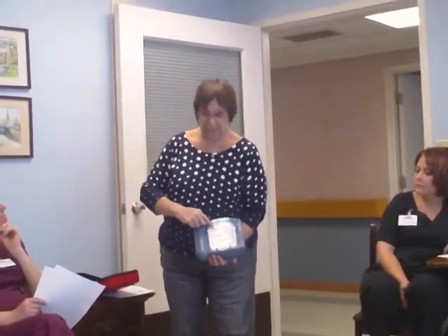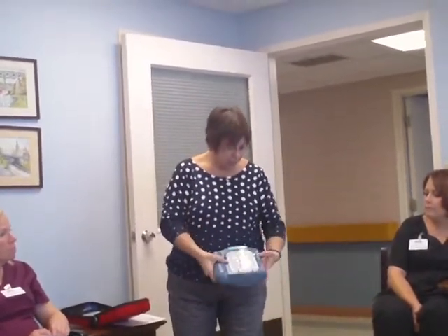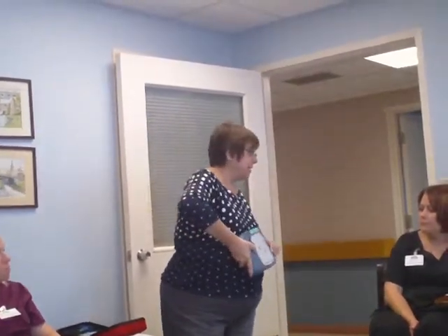This is like a cartridge in here. You pull this down and then it says peel back, and you peel back and the pads are in there. You place the pads right where they've always gone. And then you would just analyze it. If the shock is advised, this is your shock button, the orange one. It'll light up, you'll be able to figure it out.